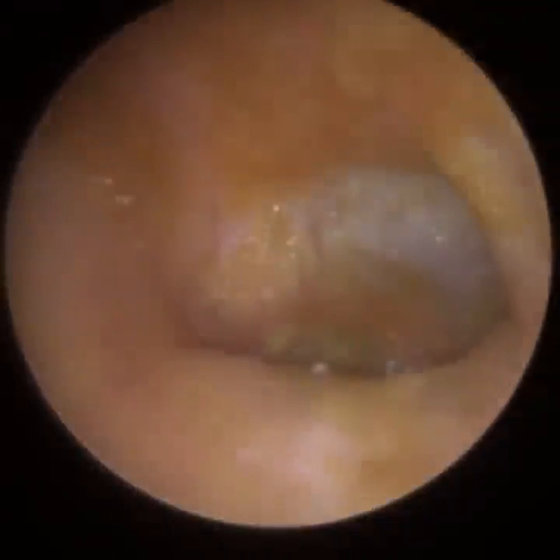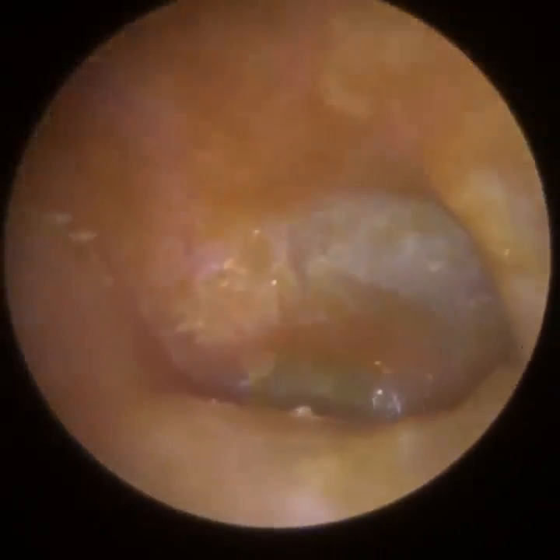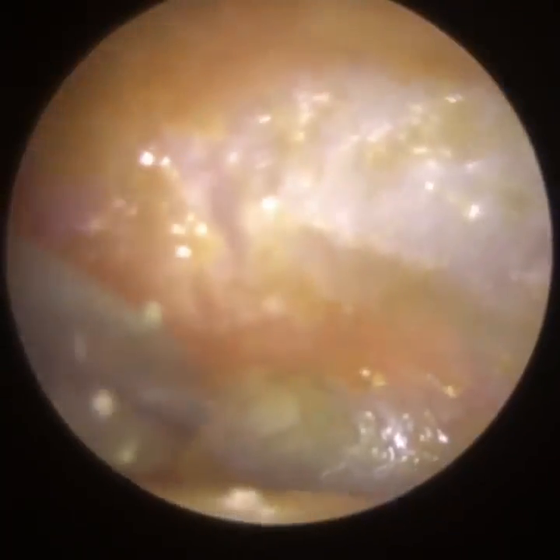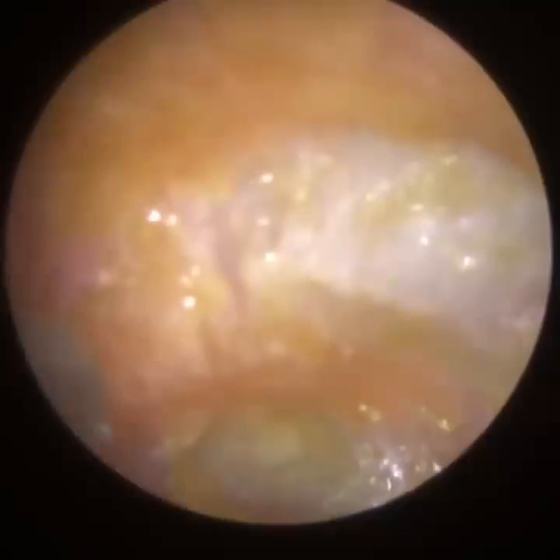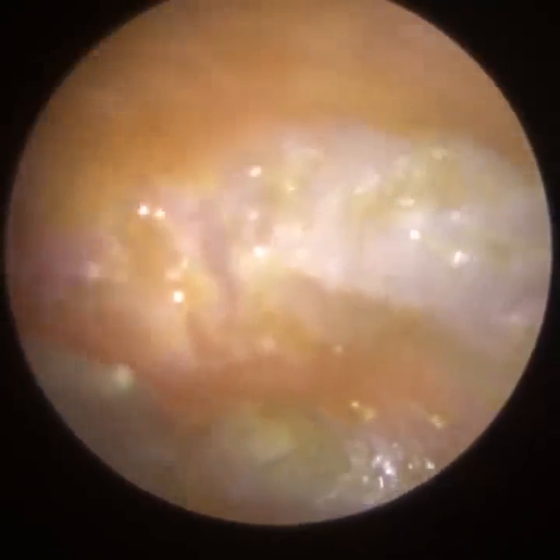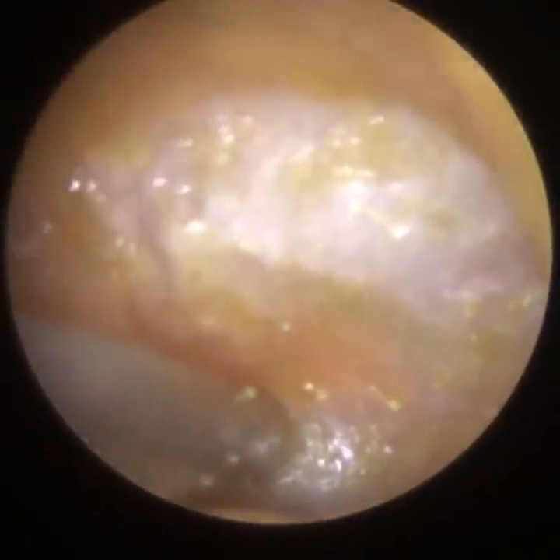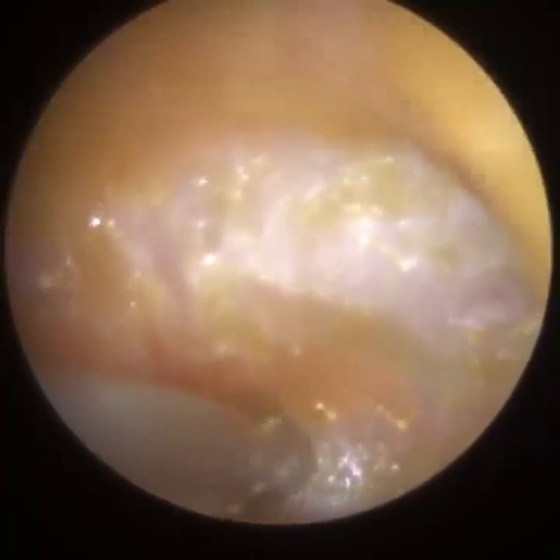The ear canal's all got discharged dead skin coating the ear canal wall and the eardrum. So it's just a bit left anteriorly on the eardrum. Can just about squeeze the fine end in there. So we'll be really delicate here. We want to avoid the canal wall to the left, but they've got the malleus, the hammer bone, which is coming out. You can see there the eardrum slightly moving, just trying to get it into that gap. The patient, this is all done under no anaesthesia. Patient's awake, comfortable throughout.